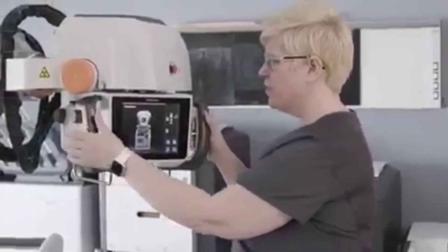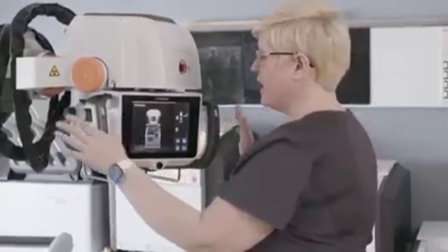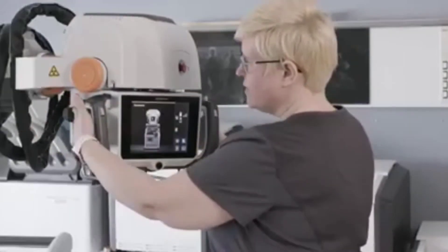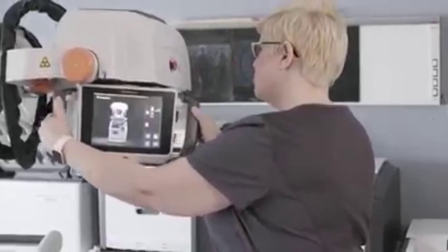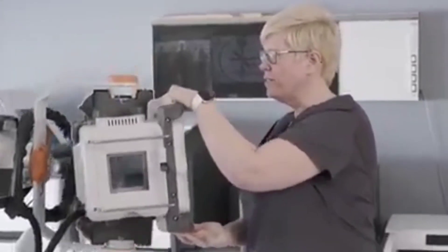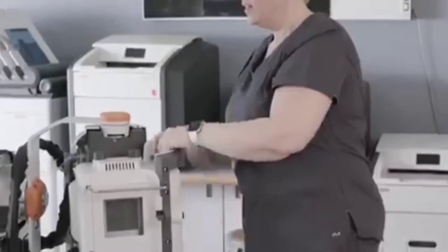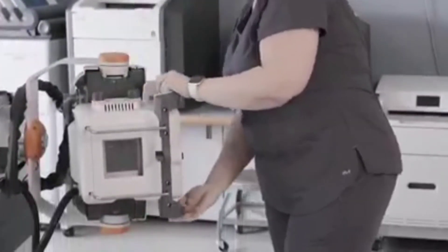The collimator knobs, which are traditionally on the front of the tube, have been redesigned and are now on both sides of the tube head. That gives the technologist access to the collimator controls regardless of their position. So if they're in a cross-table lateral situation, they can quickly grab those knobs and they're in a nice location for that.